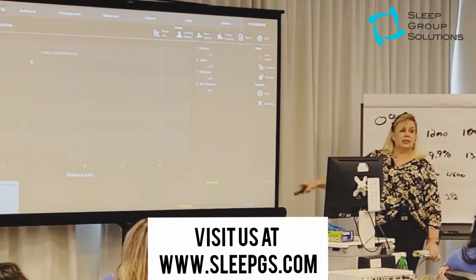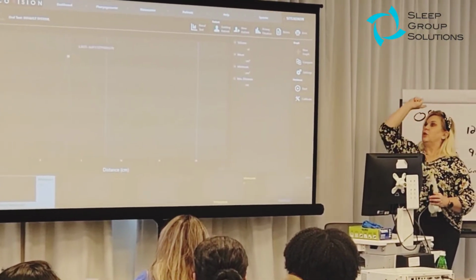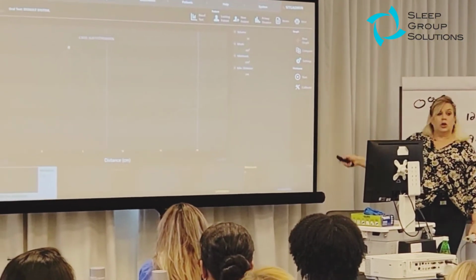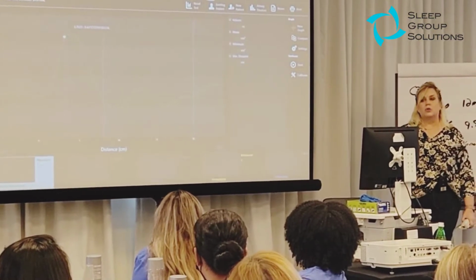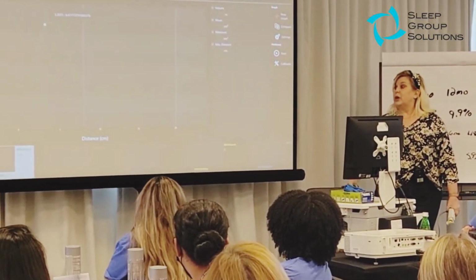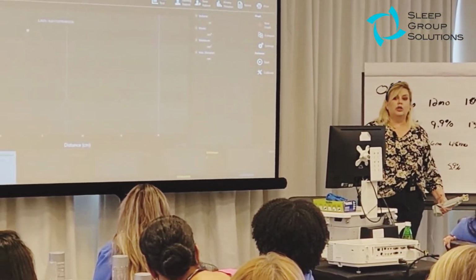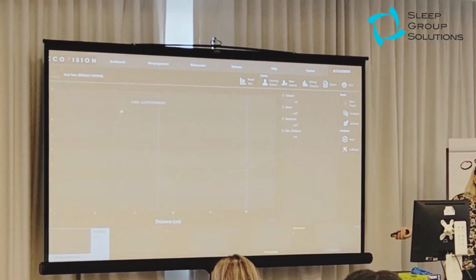So that's the side view. Chop my head down the middle, and that's that view. Over my palate, down my throat. Dr. Atul Malhotra and his team at Harvard did some extraordinarily great research with pharyngometry in his pulmonary department. And what they found is that the average airway size is 2 square centimeters at its minimum. Okay? Mine's 1.84. Not bad.